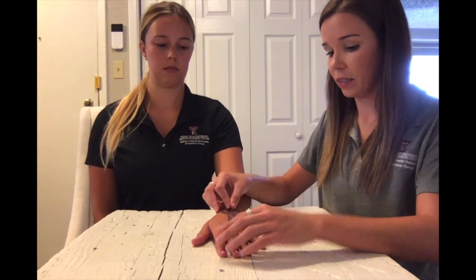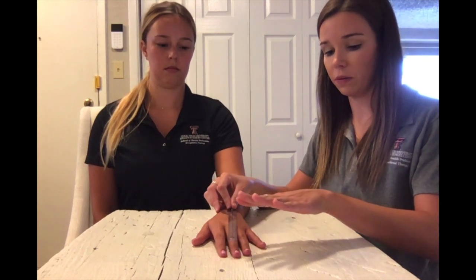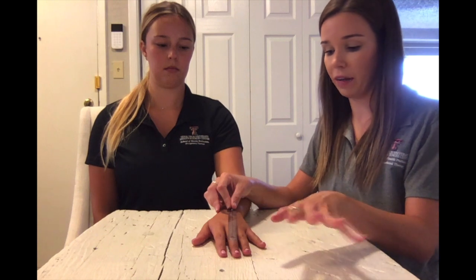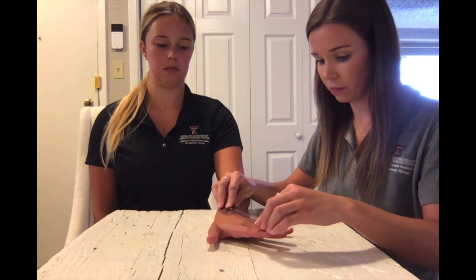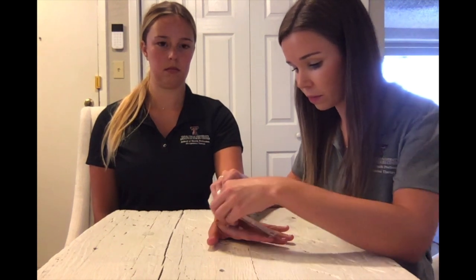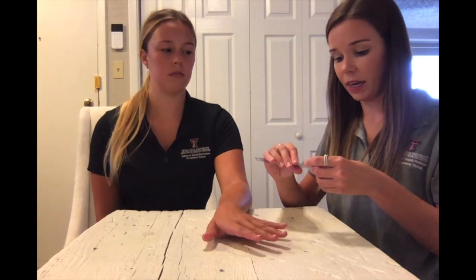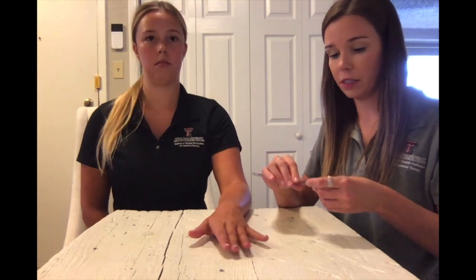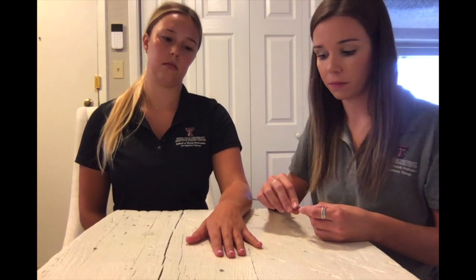Addison, I'd like you to tilt your wrist to the left for ulnar deviation. Addison has 30 degrees of ulnar deviation. The norm for this movement is approximately 30 degrees.